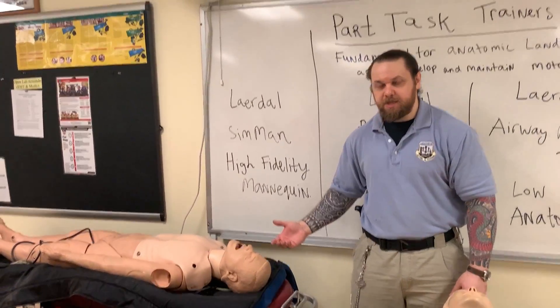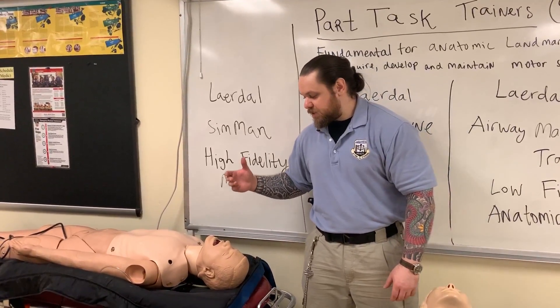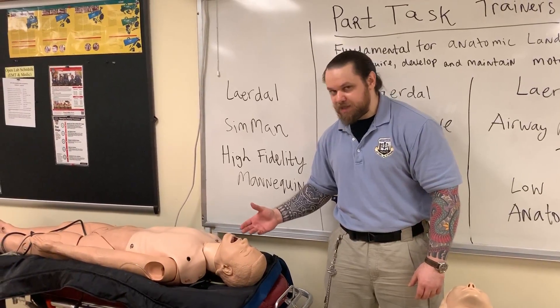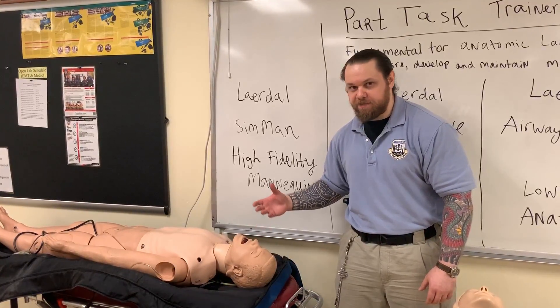This is a high-fidelity mannequin. This mannequin is very expensive and it simulates essentially what a patient may do. For example, this mannequin can vomit, can scream, and you have different controls for this. We call this high-fidelity.